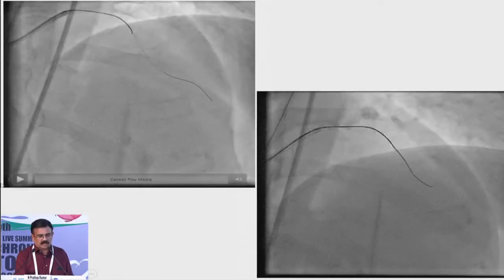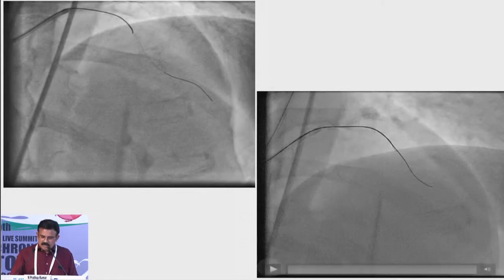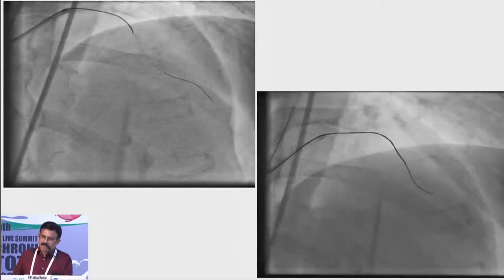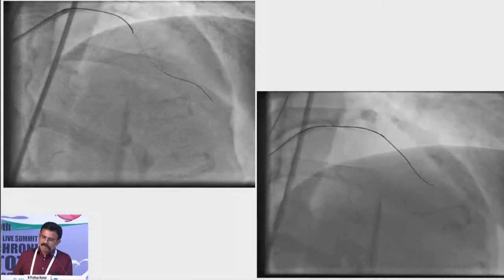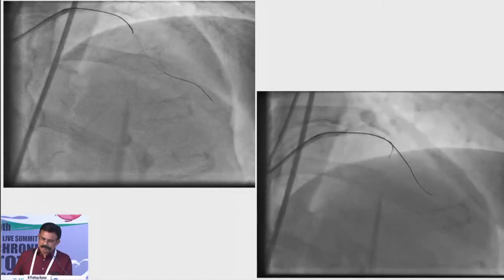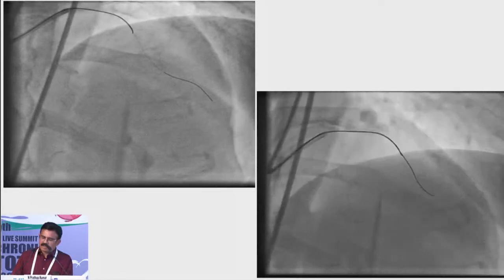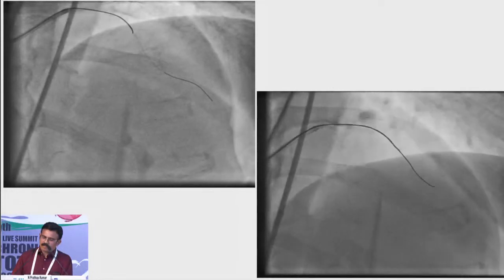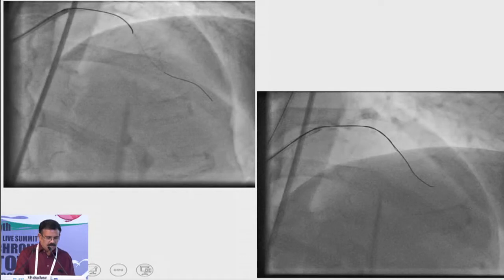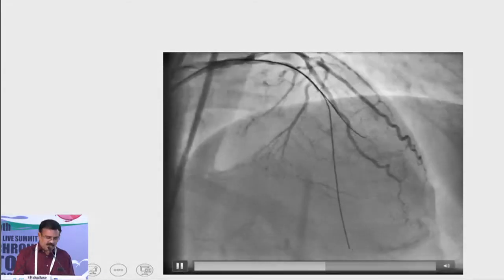Then this is the second wire coming up. With the first wire in the diagonal, we could cross it. A wire goes into multiple places, but the second wire helps in taking the wire down. Small injection showing the LAD, then I could cross the lesion down. Crossed already with the technology.